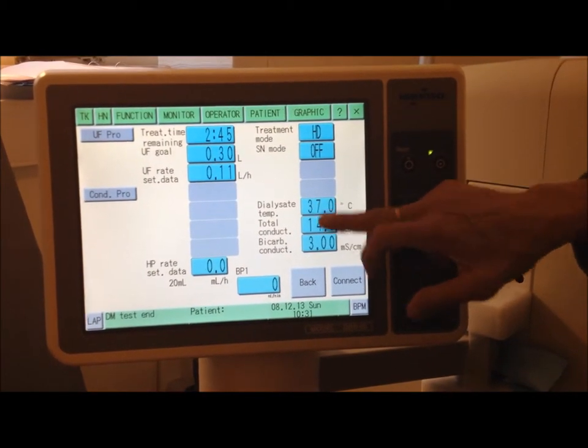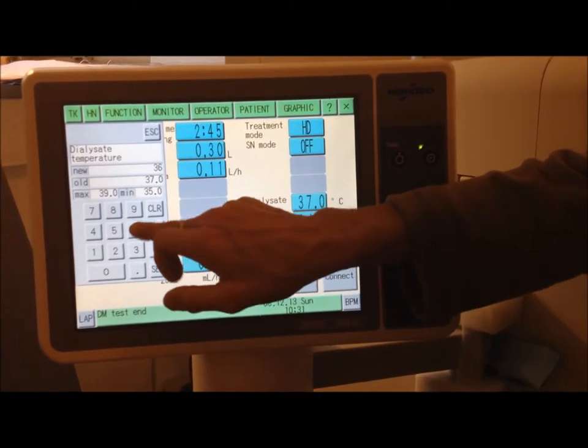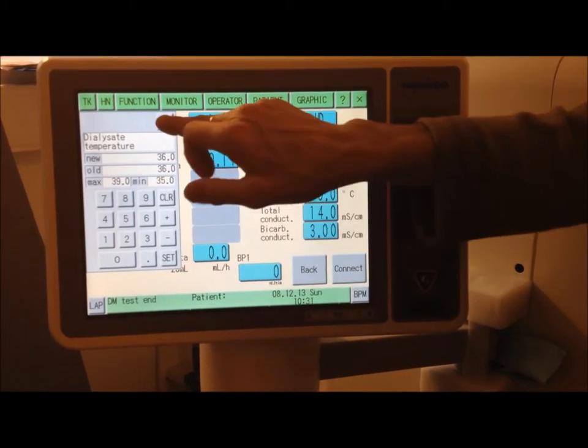Dialysis temperature — that's how many degrees. 36. Set that, come out of that.